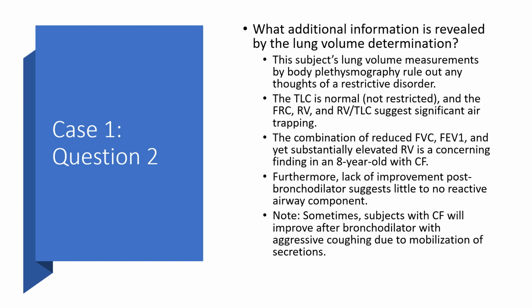So let's take a look at another question regarding the same case, the cystic fibrosis patient. What additional information is revealed by lung volume determination? That was really emphasizing flows. The subject's lung volume measurements by body plethysmography, the body box, rule out any thoughts of a restrictive disorder.